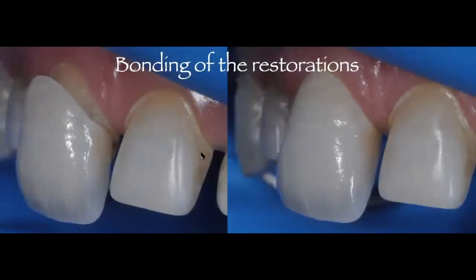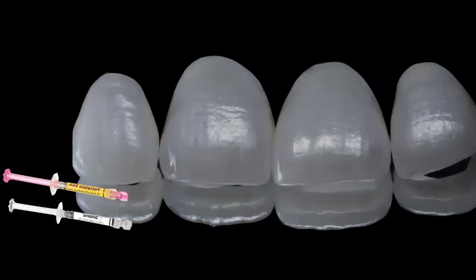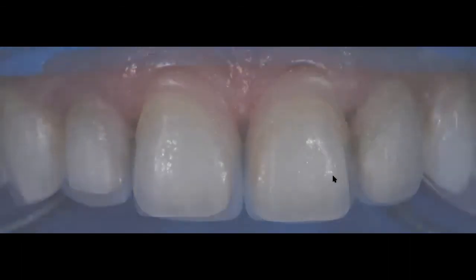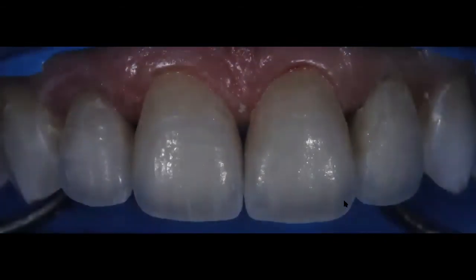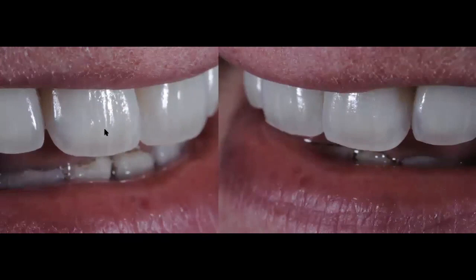When you're doing your try-in, you can see they fit beautifully. But again, look at the crack lines, all those little things that they did, because this patient, in her canines, she had all these features. So we wanted to make sure that we reproduce them in these veneers that we were going to deliver, so that they had, and you can see, look at the halo, the craze lines. And again, look at the beautiful ceramic here. And this is all about the dental technician. This is not about me.